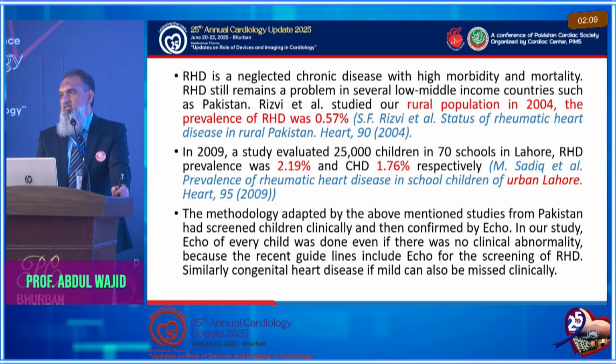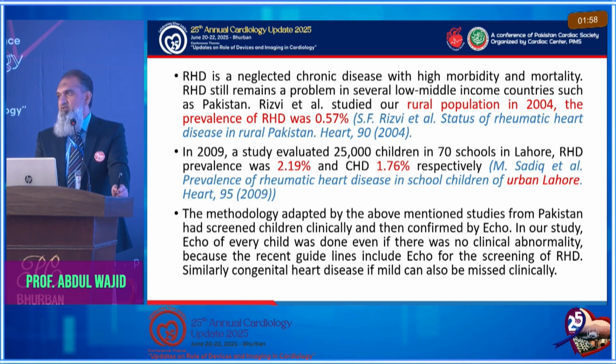So I don't want to miss anyone, and that's why 70% of echoes are almost all done by myself, and 90% of echoes are done on the main echo machine. Only 10% of echoes are done on the Butterfly machine. So I don't want to miss anyone.